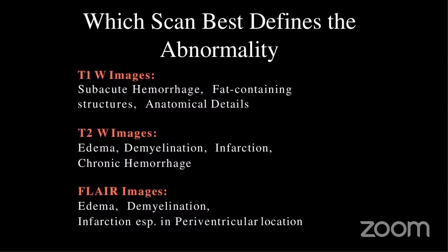So you have to always correlate or look into the requisition. This is when the clinical details become important. Sometimes if you do not have any radiologists around to ask which sequences you are supposed to put, just look into it. See what the clinicians want to see. Based on that, you can tailor your protocol.